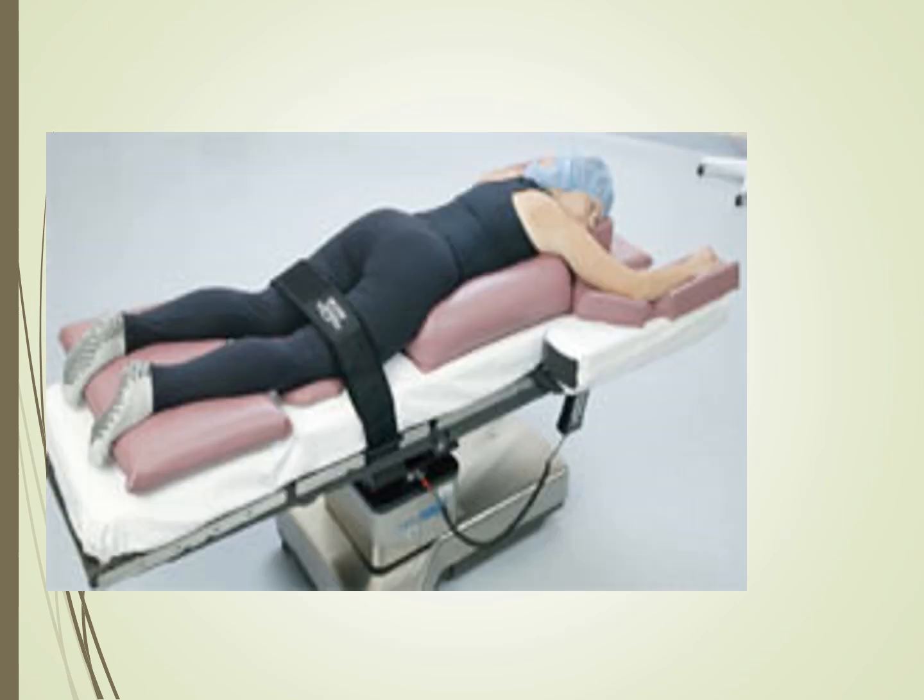I just wanted to show you a very poor picture of the prone position. This is not the one you would see in the ICU, so you know what you've got to look for in the ICU.